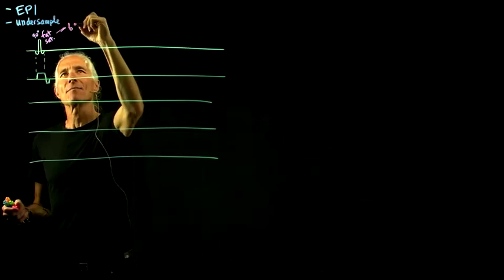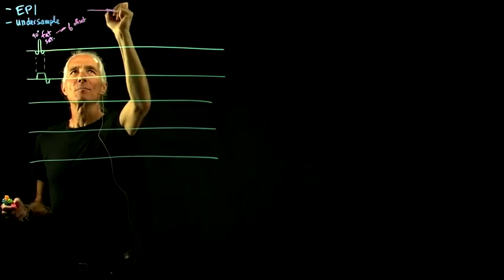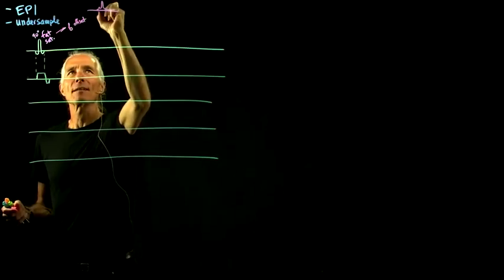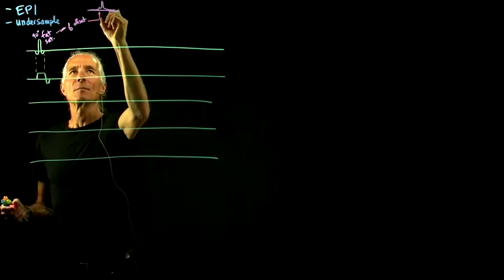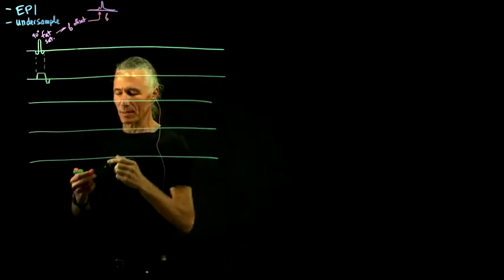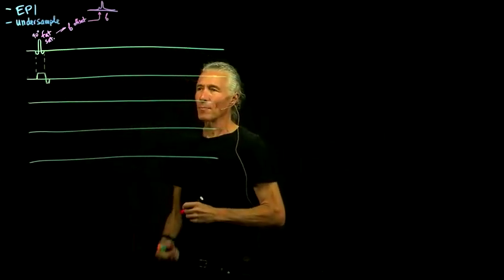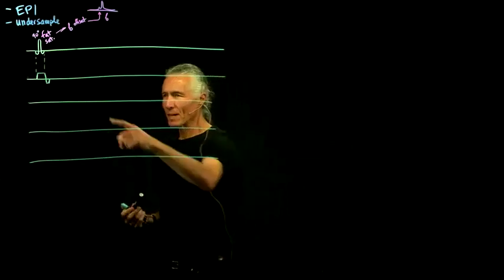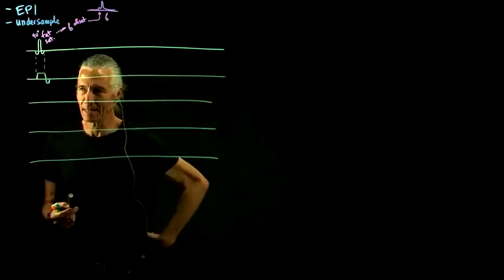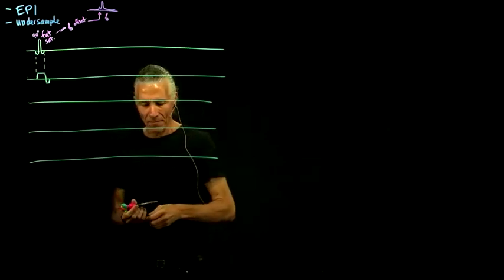is offset, because the frequency of water, which is most protons, is here, and then the frequency of fat is a little off to the side. So basically we do an RF pulse that's offset in frequency so that we only hit the fat protons. But we still have to do a slice select and then fix the slice select in order to just do that for the current slice we're working on.